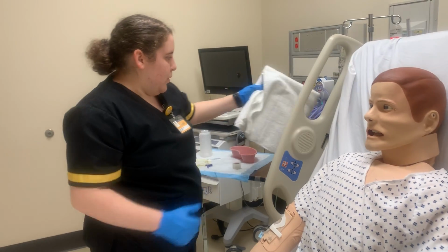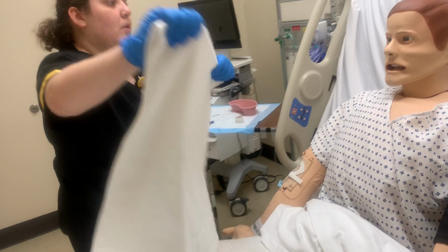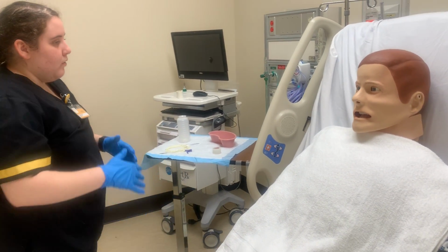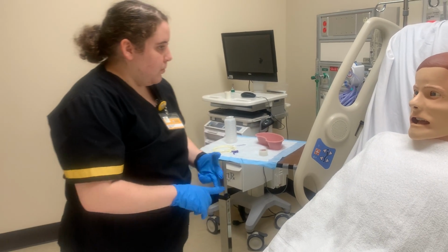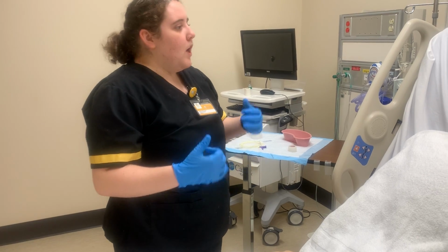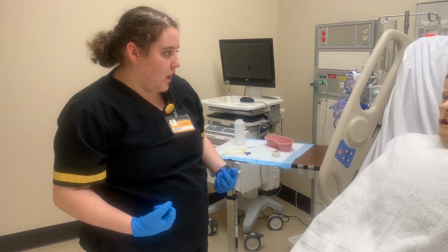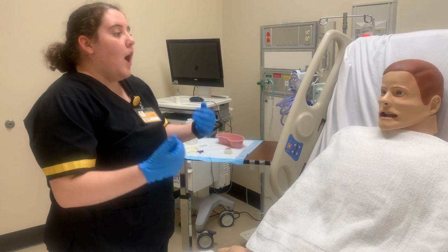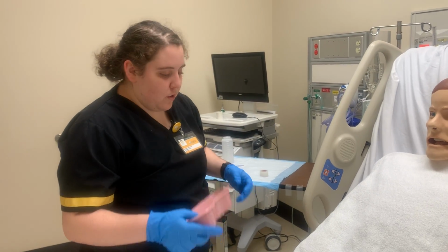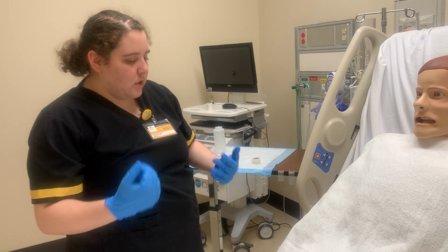So I'm going to quickly drape you with a towel. That way, if there is any mess to be made, it will go on the towel and not on you. There are a few complications with this procedure, so if you feel any difficulty breathing or speaking, feel like you have to cough and you're choking or need to gag, let me know and I will stop the procedure immediately. And if I see any signs of cyanosis, which is when you'll start to turn blue, I will also stop then. So this is a spit basin, so if you feel nauseous or need to throw up at any time, just let me know and we can pause so you can throw up.